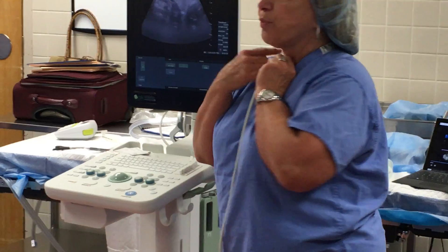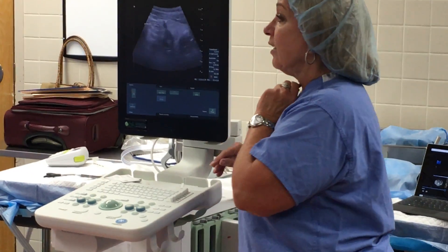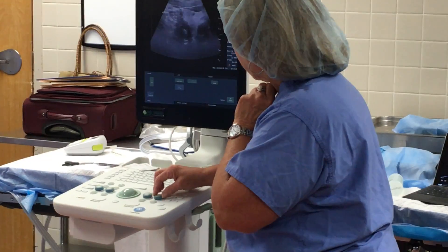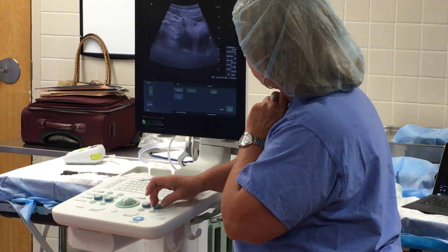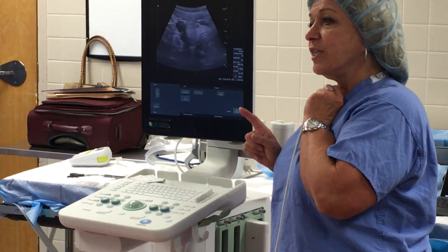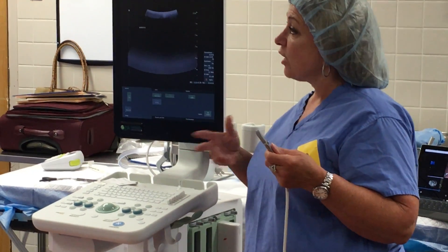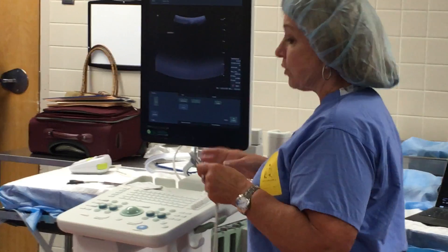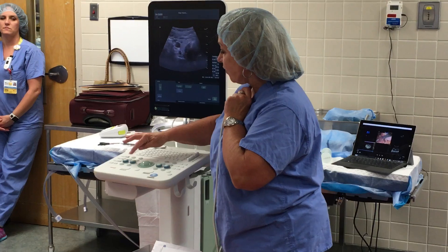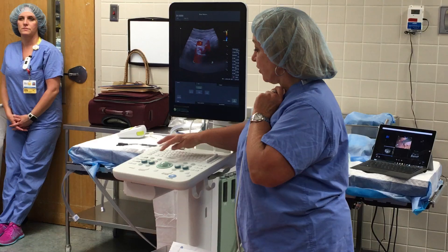I'm going to leave this probe out here — if you want to practice on your patients just click the button. You're not going to ruin anything, and it's better to do it while I'm here so if anything's broken it's on us. This is the depth button — see these centimeter increments here? You can make the picture larger or smaller. This machine uses gaming technology for quickness, so the color sensitivity is incredible compared to most ultrasound machines. If they want to see color, all you do is push it, and push again to turn the color off.